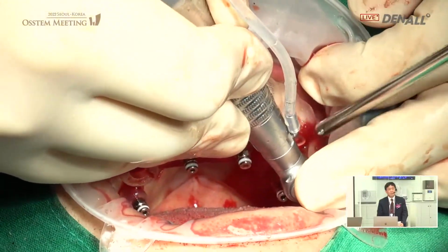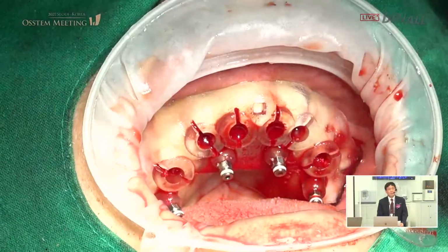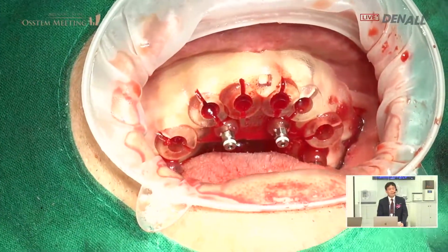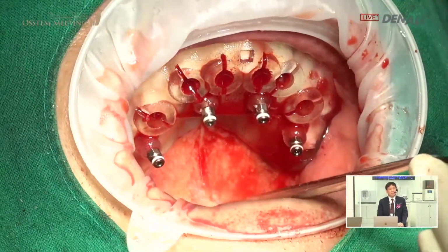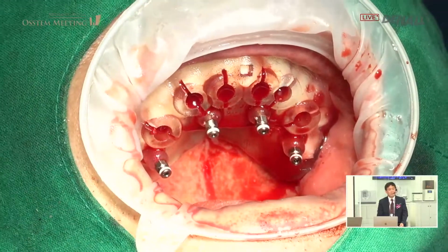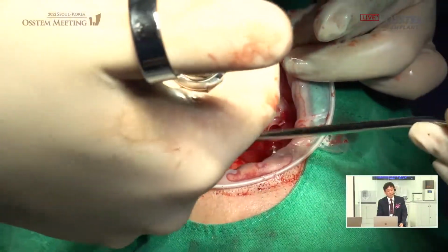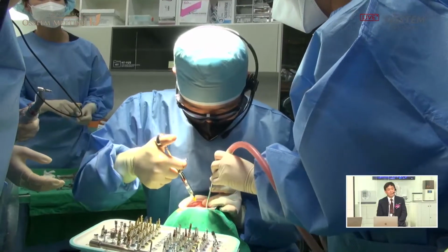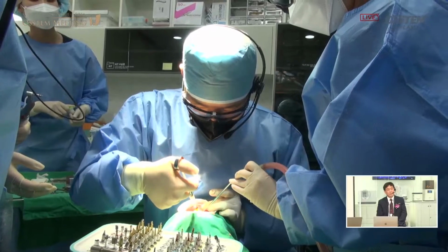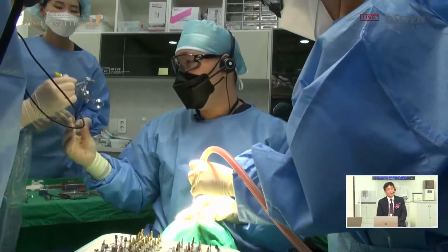There is sinus as well as the inferior border of the nasal cavity, so I'm going to use a size longer drill to prep the site before placement. Number 21. Anesthesia, it's not really being done. I'm going to do it once again. Relax a little bit. Okay.